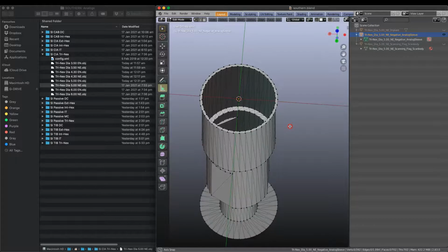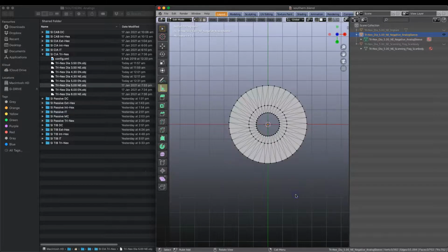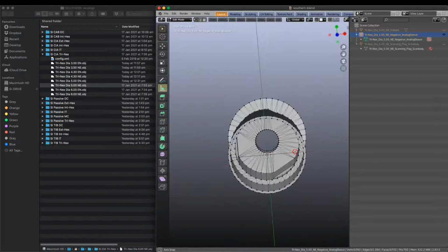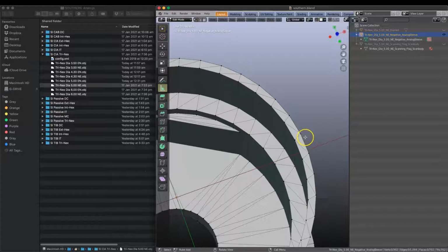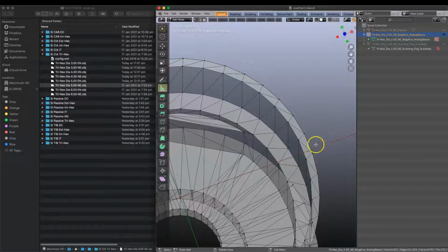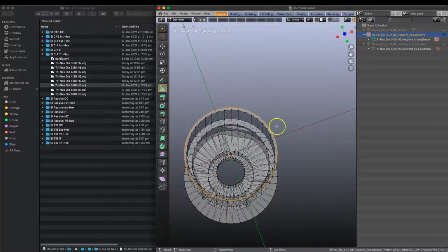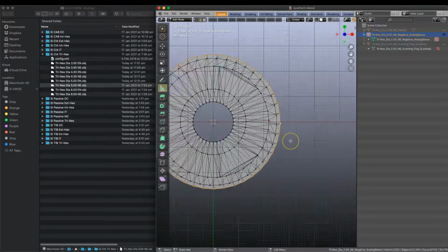Alright, so the other thing is you've got to use the tilde key here, because we have to view the part from exactly the front or the top or whichever. What we need to do is select the edge loop here. So my cross mouse here will just place it between the two vertices. And the other thing is you've got to make sure you work in transparent mode here, so we can see what's happening with the grid later on. So I'm going to select edge select this one here. So you're going to press Alt and left click. So you can see the perimeter is outlined. Then by using the tilde key, we want to look at the part from the top.